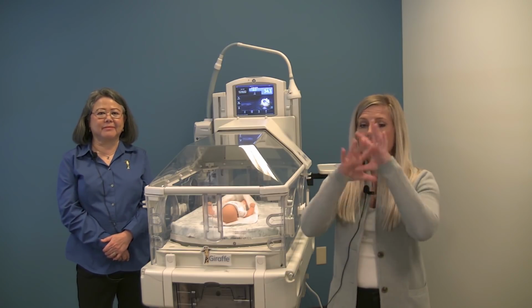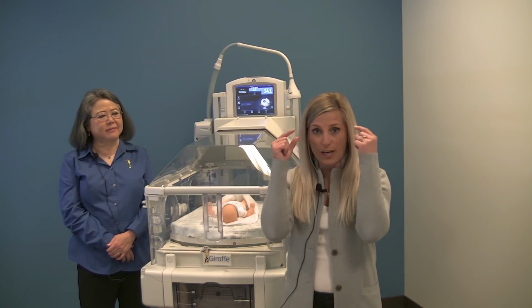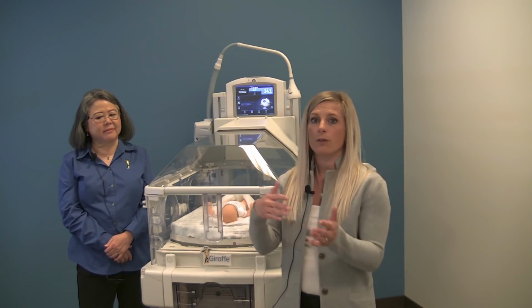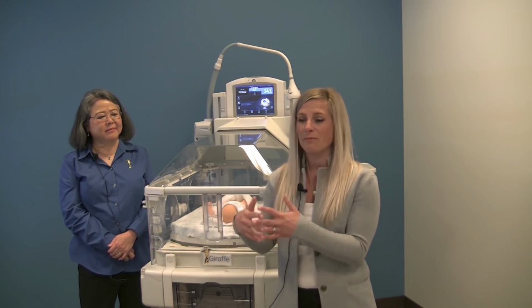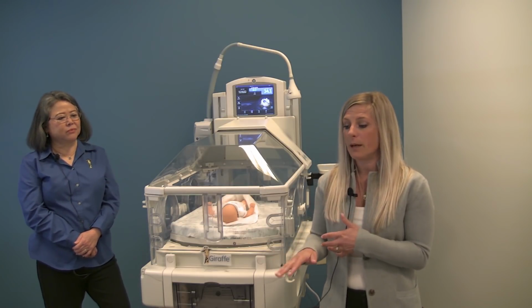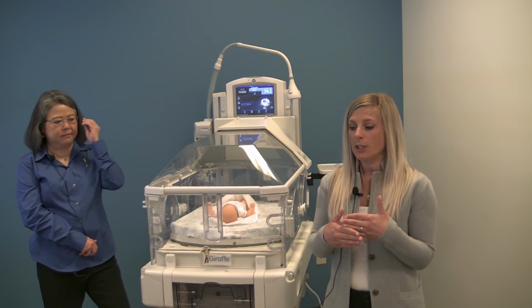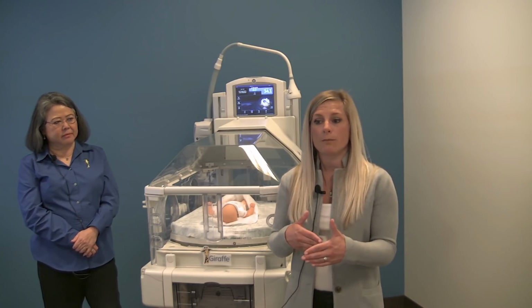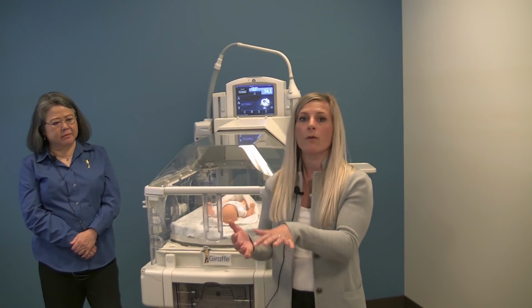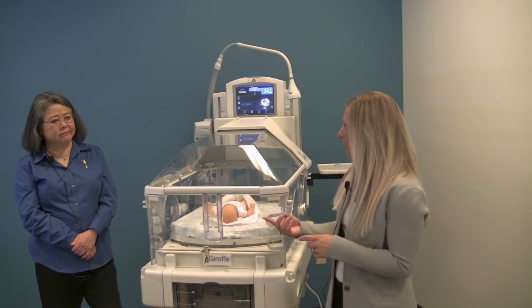There are many different brands and avenues of purchasing to get blue blocking shades or glasses. Some facilities already have them in stock. Others may choose to go to a regular store or website and purchase some for mom and dad. Certainly you can give them those if they have complaints. Per our manual and our recommendations, it's not required. It's simply if this would make it easier on the parent, then absolutely. If we're using in-room phototherapy and that blue light's bothering them, get them those blue blocking shades.